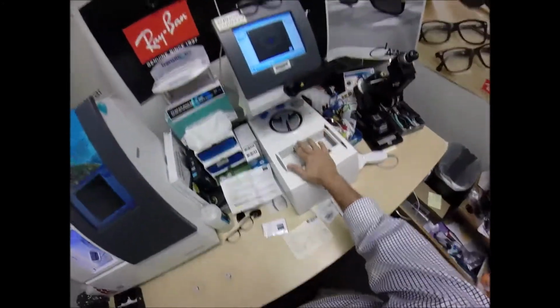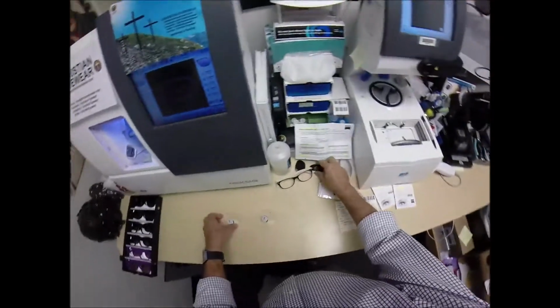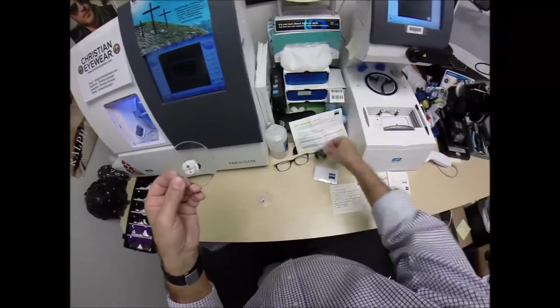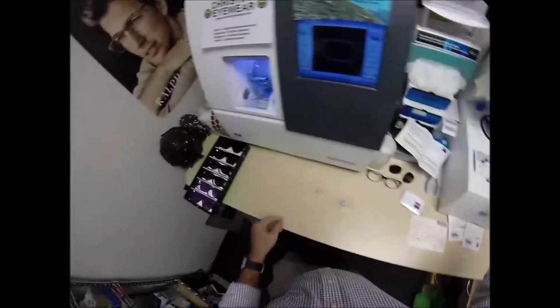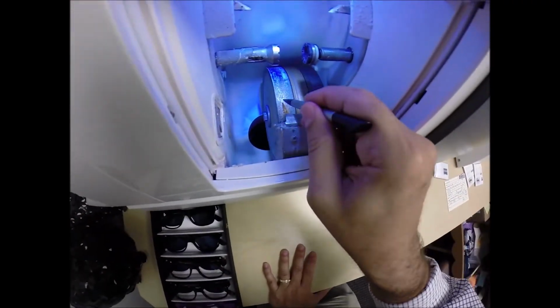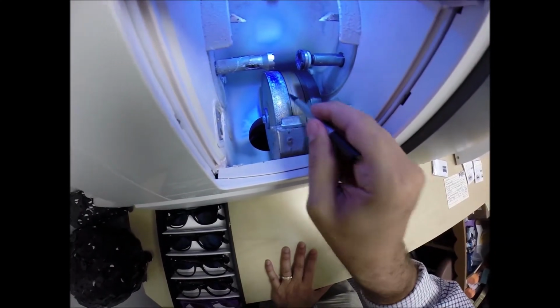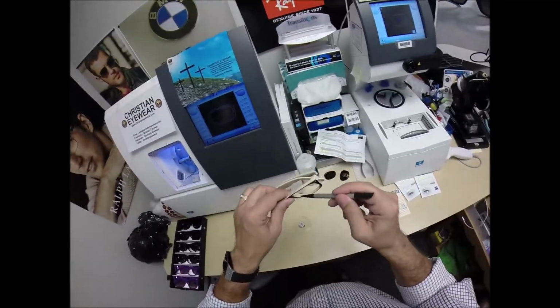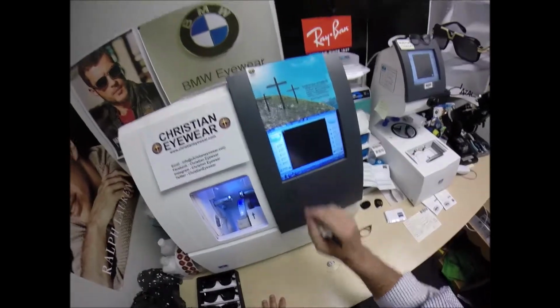So, this is the tracer, this is the blocker, this is the edger. It's going to edge your lenses down from this size to this size. Actually, it's going to do the right lens. This size for the right lens. It does so by using this cutting wheel, which is a diamond-crusted wheel that's going to grind away your lens material till it's the final size. This wheel in the center is going to put the V-shaped bevel on the lens so it stays inside the bevel of the frame. So I'm going to wake up the computer.